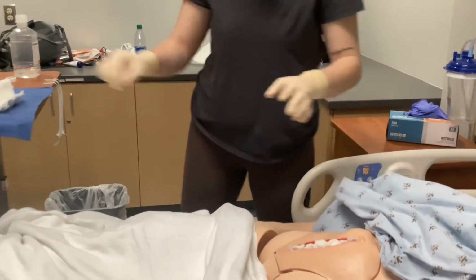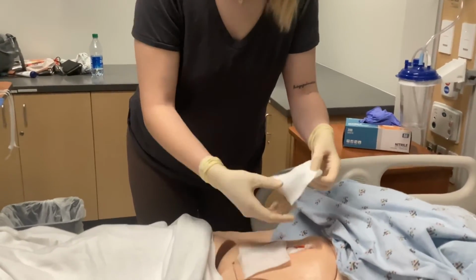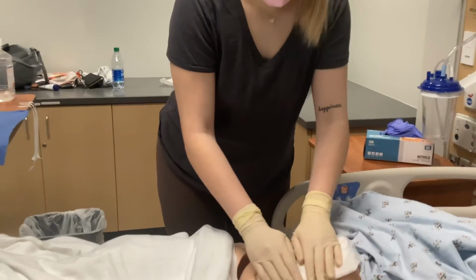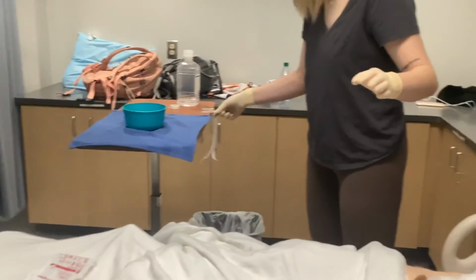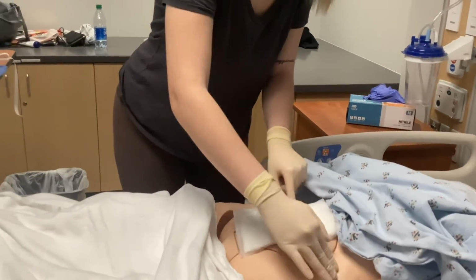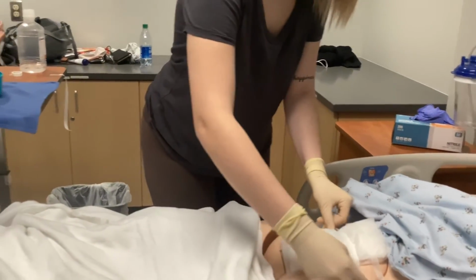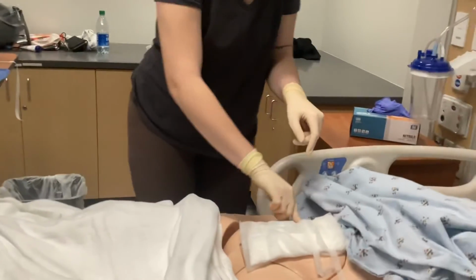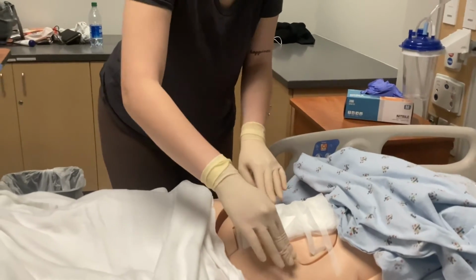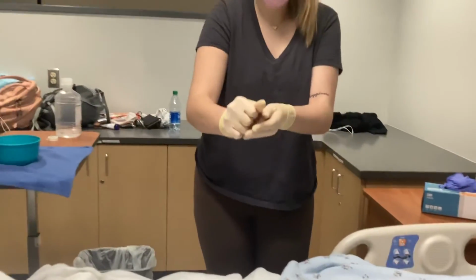All right, now that the wound is packed, I'm going to apply my 4x4. All right, now I'm going to apply my ABD pad. Now, at this time, my gloves are no longer sterile since the wound is completely covered, and I'll apply the tape one by one. All right, Mr. Jones, does that feel okay for you? I'm going to pull down the gown, remove my gloves.